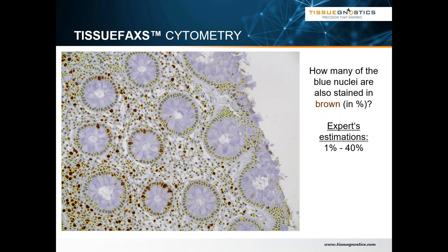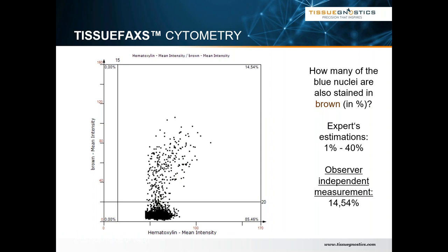Once we have these nuclei segmented, we can measure the expression of the brown channel using the contours of the nuclei that we found. This enables us to get an observer-independent measurement, along with a tool that looks very similar to flow cytometry — the famous scattergram, which you'll see in all of our image analysis software. That's probably also why DeNovo and Tissue Gnostics partnered up — because of our shared taste in image analysis and flow cytometry. You set your cutoff using an isotype-matched negative control in your experiment and can apply that to the rest of your sample, always getting an observer-independent measurement.